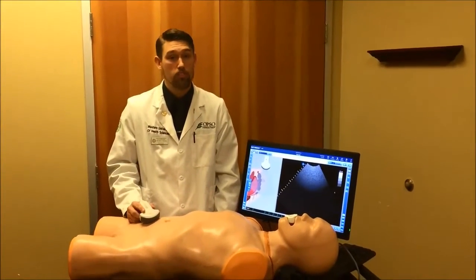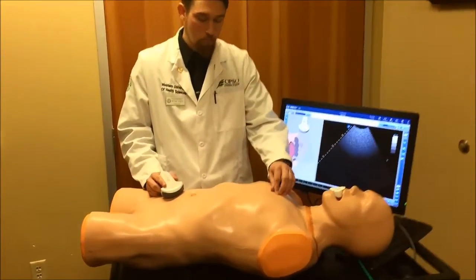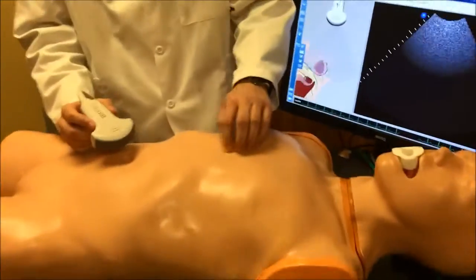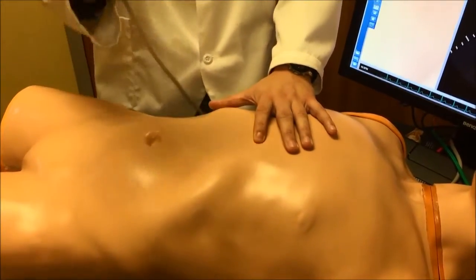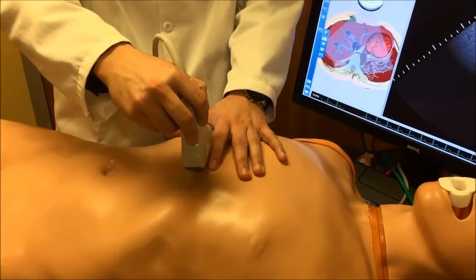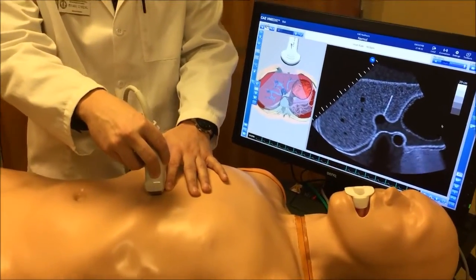First, we will demonstrate the subxiphoid view. We'll begin by palpating the sternum and moving inferiorly until we reach the xiphoid process. Once the xiphoid process is reached, we will take the probe and place it inferiorly to it, with the indicator pointed to the patient's right.